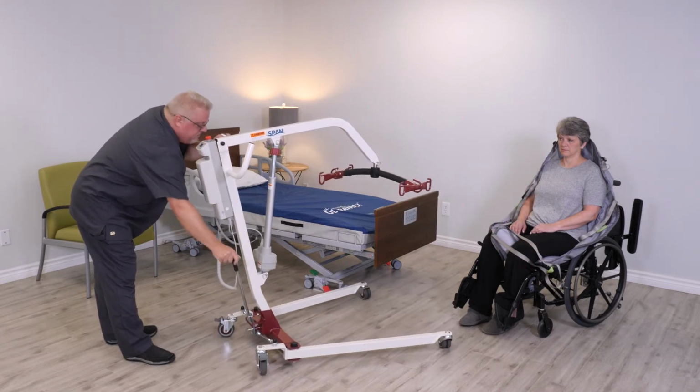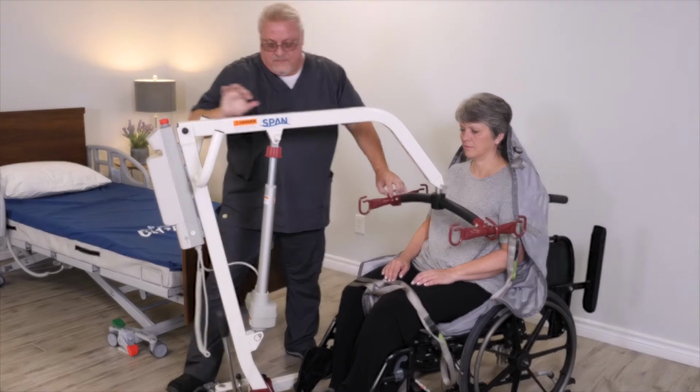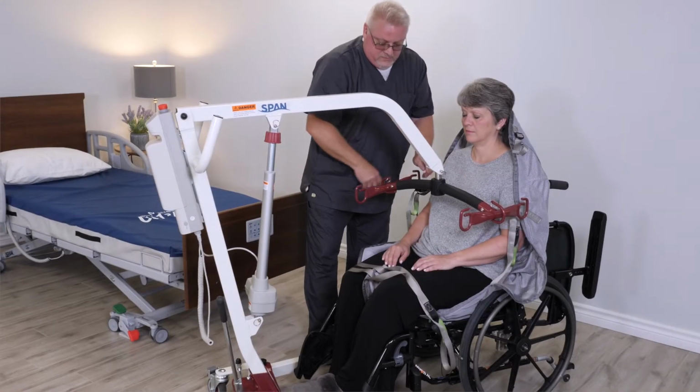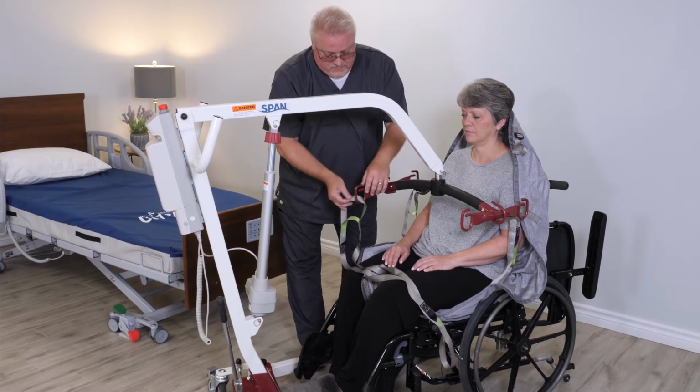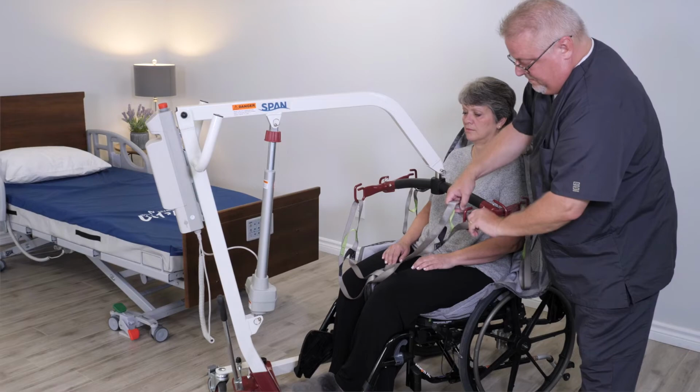Open the base of the lift, approach the patient, position the lift, attach the shoulder loops to the first set of hooks closest to the patient. Then cross-connect the leg loops into the loops closest to the lift.